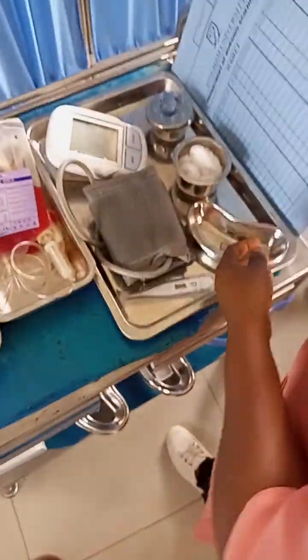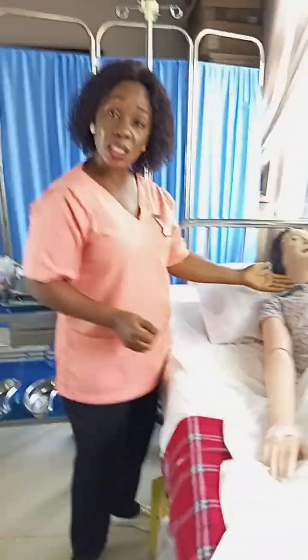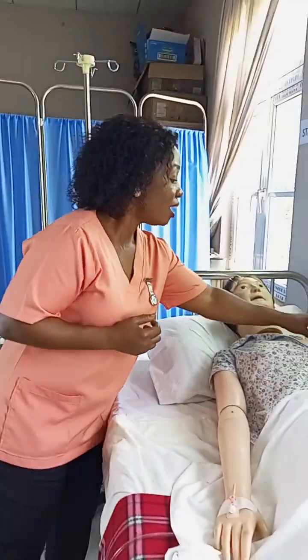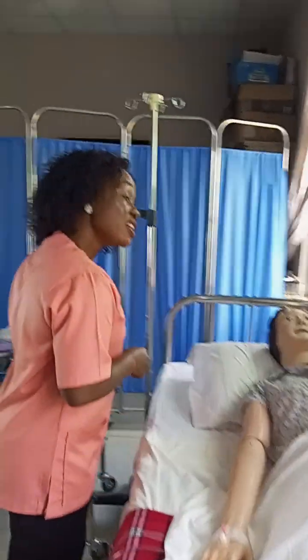The next thing is for you as a student nurse to come to your patient, introduce yourself, and obtain consent. So now, good morning. How are you today? Please can you tell me your full name and your date of birth? As the patient is telling you his or her full name and date of birth, you cross-check it from the file to see whether it matches, and you check it again.